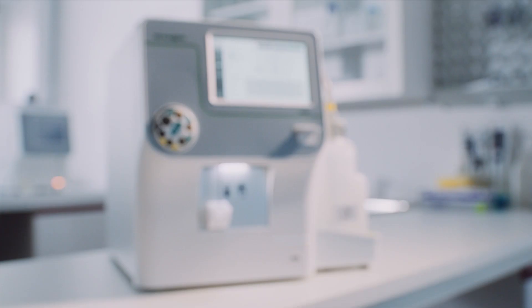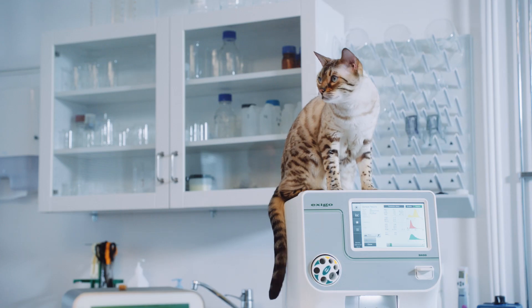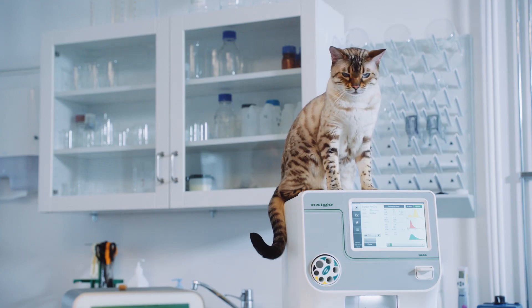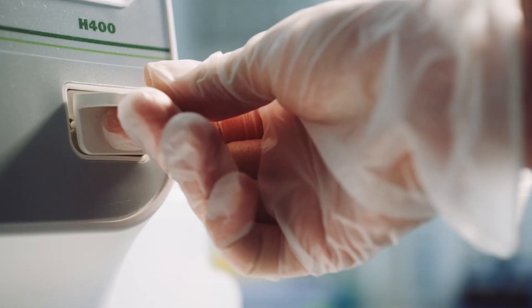With its innovative technology and outstanding performance, accuracy, and quality, Exigo H400 is a leading veterinary hematology analyzer. It provides a complete blood count, including a four-part differential.